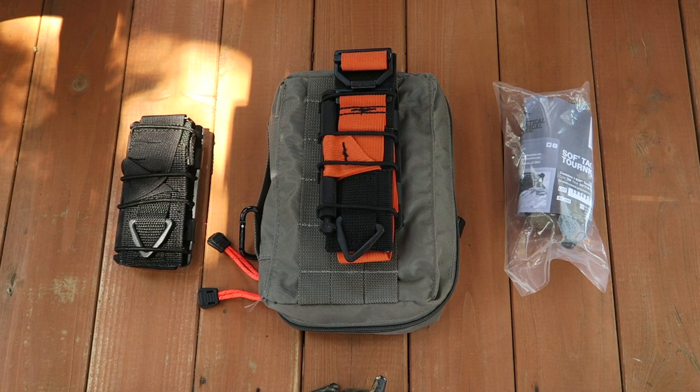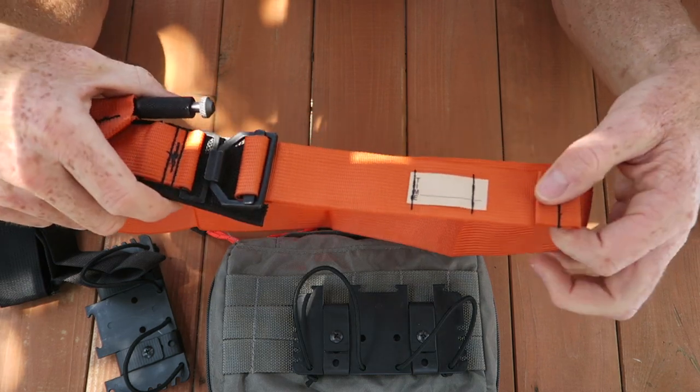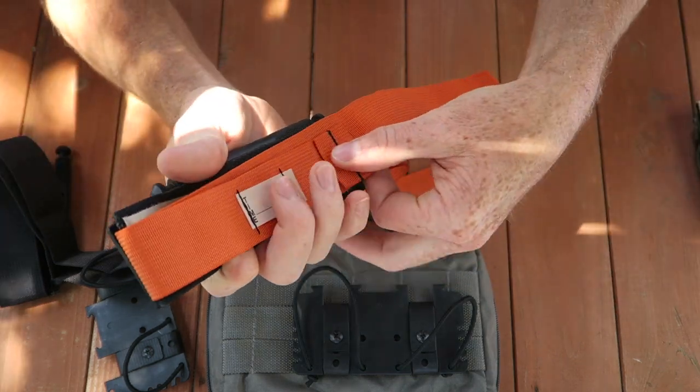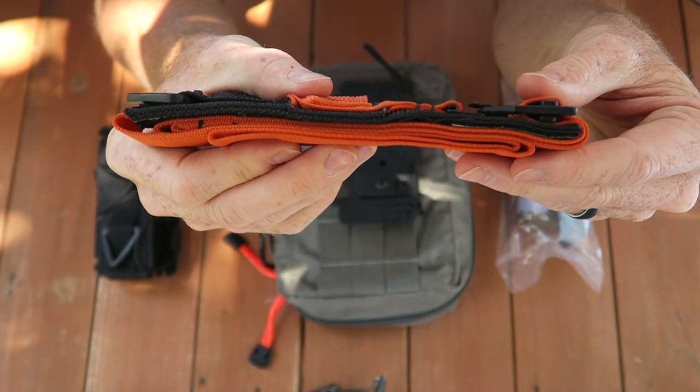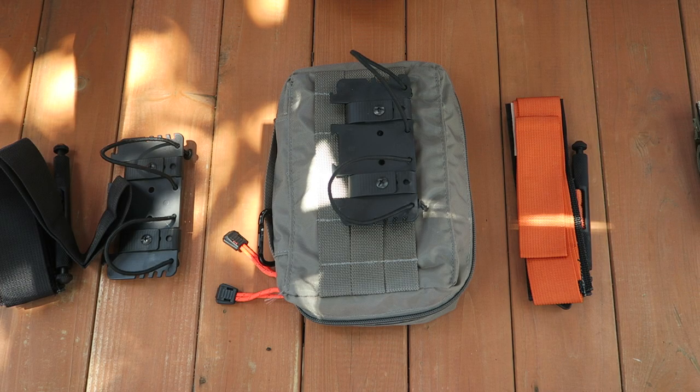Hey guys, it's Cody with Option Gray. I received a number of requests to show how I flat pack my tourniquets, so I thought I would make a quick video to demonstrate just how I do that.